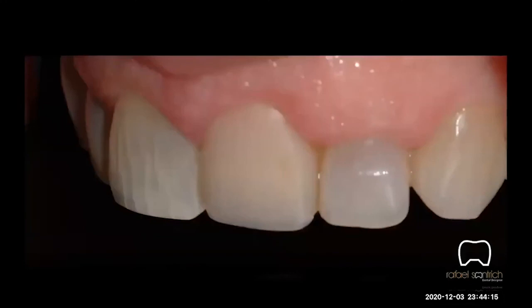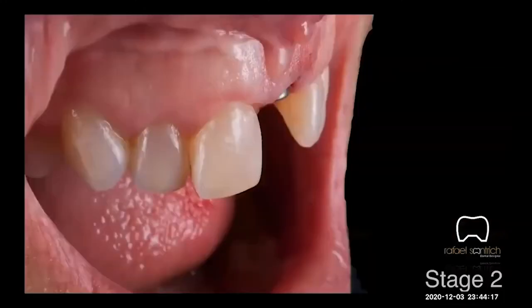So this is a really important case. It is the wife of one dentist who worked with me for several years, and he tried to maintain her teeth in the mouth for years and years, doing composite here, composite there. But you know what? The tooth has a big root reabsorption, some big lesions. So he decided to place an implant. This is the day that I met her in the second stage.